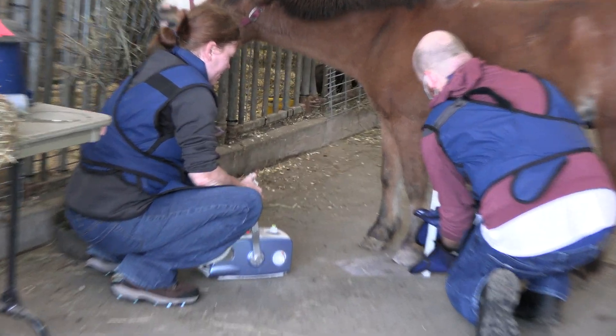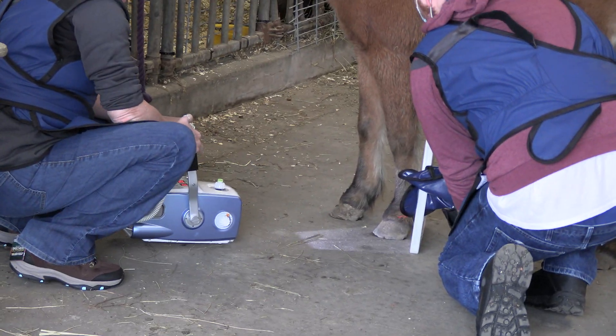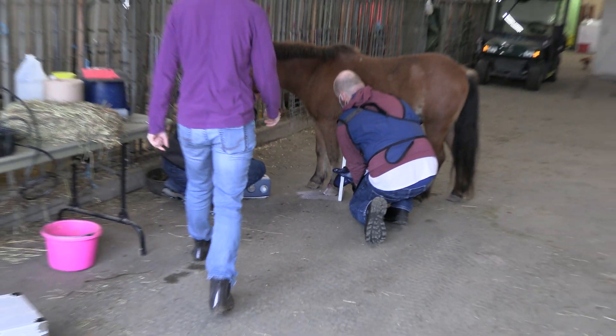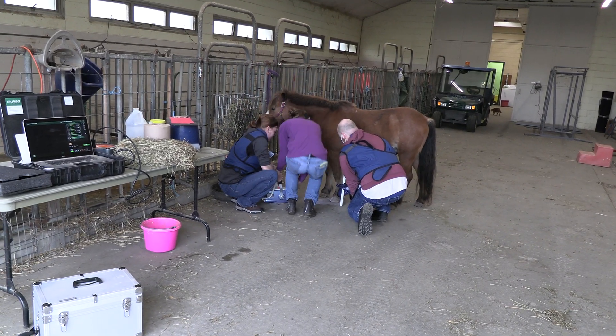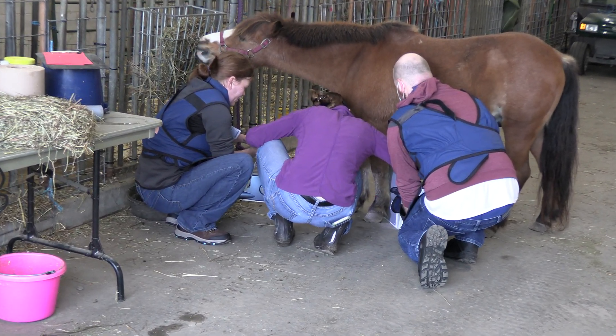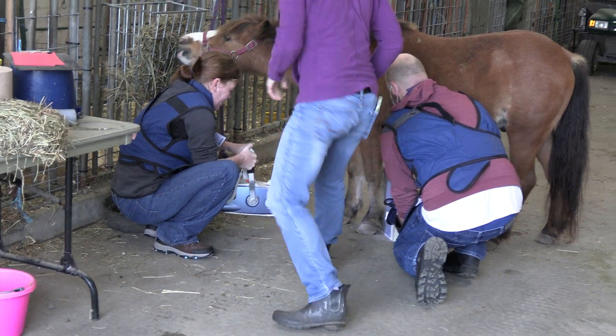Your plate holder is helping you out. Where is the DP? You want to be directly in front of it, right? It's your DP, or it's your palmar, if you want to be. So right now, I'll put this right away. That's your DP.